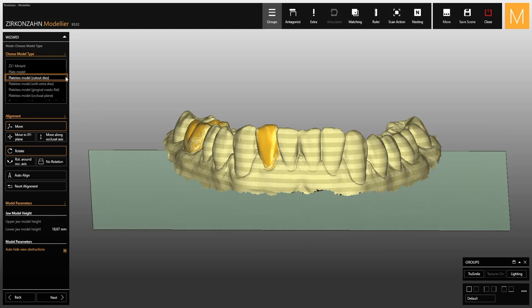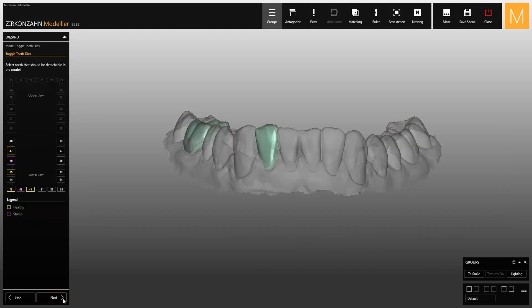It is important to select this model type. Afterwards, the software allows you to choose adjacent removable teeth for teeth on which the temporary crowns have been created. You do not need to modify anything in this step.